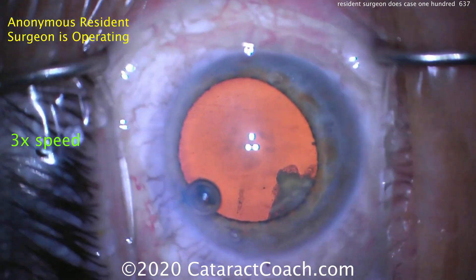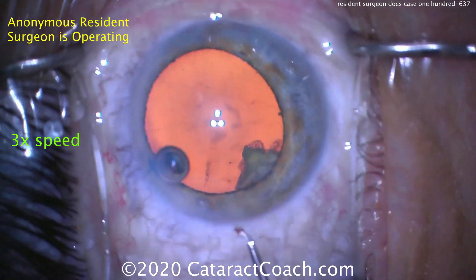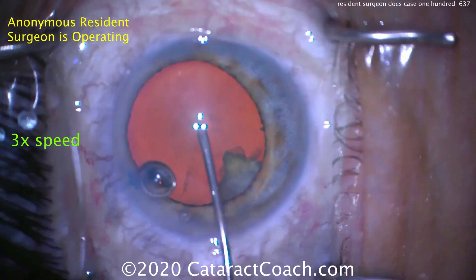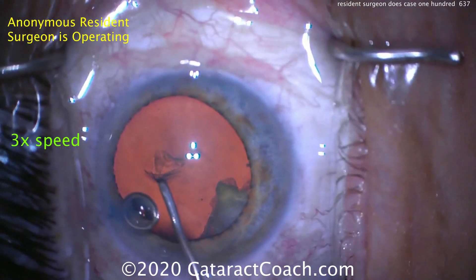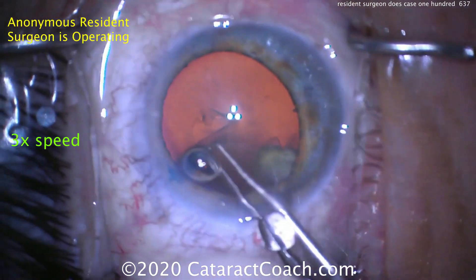Time for the capsulorexis. Now there is some motion here on the patient — it's kind of amplified when we show the video at three times normal speed. Starting off the capsulorexis here with a cystitome. That looks good. And switching over now to the forceps.